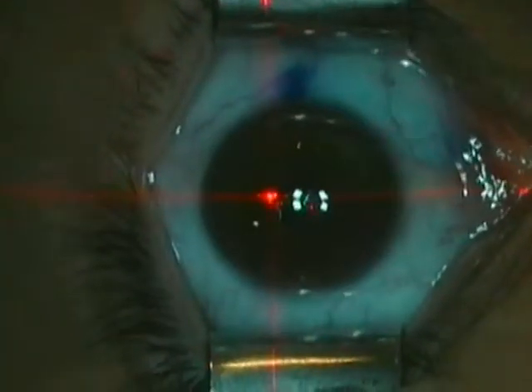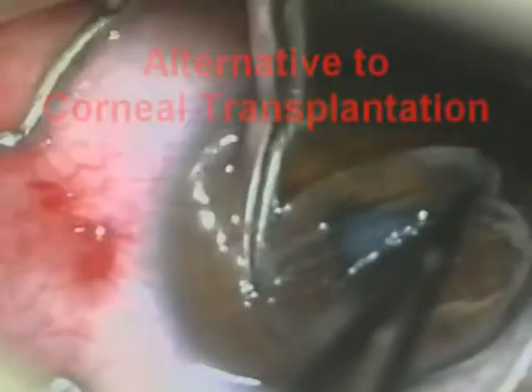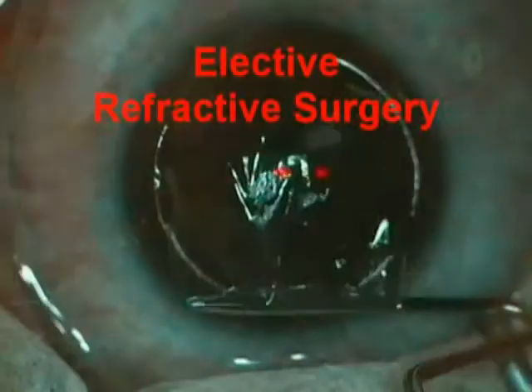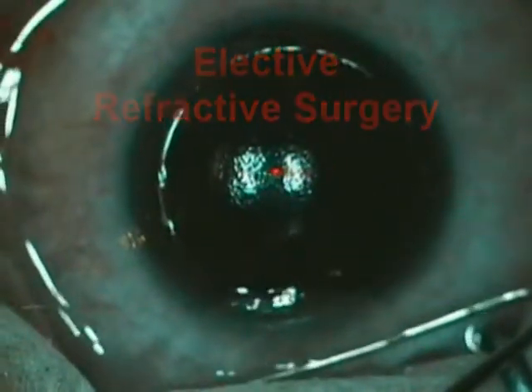Therapeutic custom ablations are indicated for special cases where visual acuity with glasses or contact lenses is not satisfactory. In this video, we discuss therapeutic ablations as an alternative to corneal transplantation that must be differentiated from elective refractive surgery, and show representative cases of therapeutic ablations that represent our daily practice.